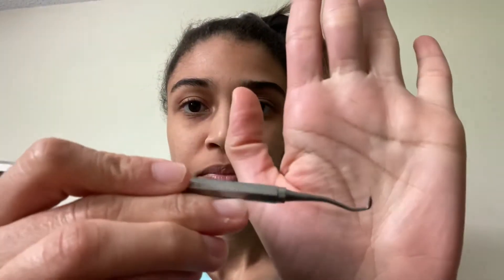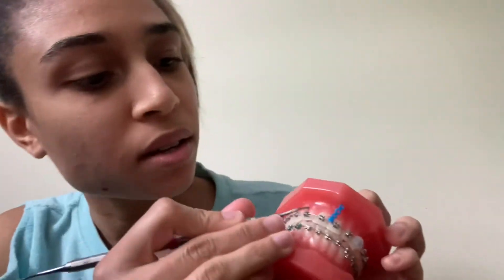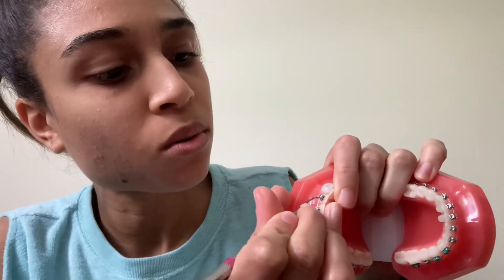These are in no specific order. So this is a scaler — this is the working end, this is the broken end. You can remove debris from the tooth with this. With our self-ligating doors we use it to open the doors. So the scaler can be used for multiple functions.